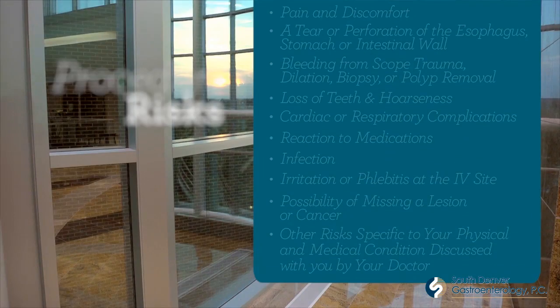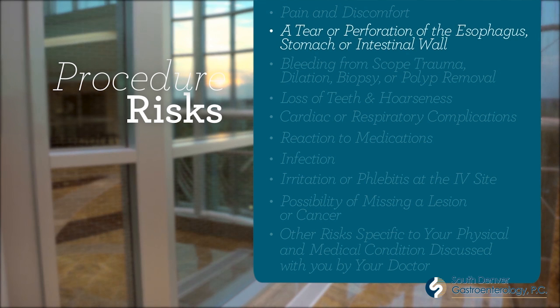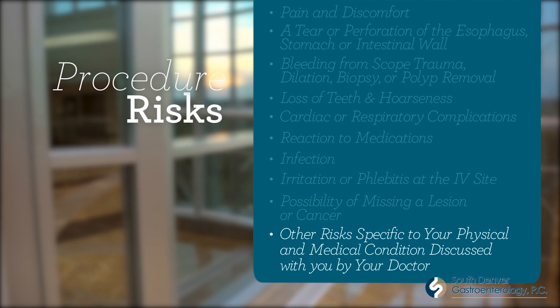EGD is usually safe and associated with a very low risk. However, you should be aware of any possible associated risks. Risks include pain and discomfort, a tear or perforation of the esophagus, stomach, or intestinal wall. Bleeding can occur from scope trauma, dilation, biopsy, or polyp removal. Loss of teeth, hoarseness, cardiac or respiratory complications, reactions to medications, infections, irritation or phlebitis at the IV site, possibility of missing a lesion or cancer, and other risks specific to your physical and medical condition as discussed with you by your doctor.